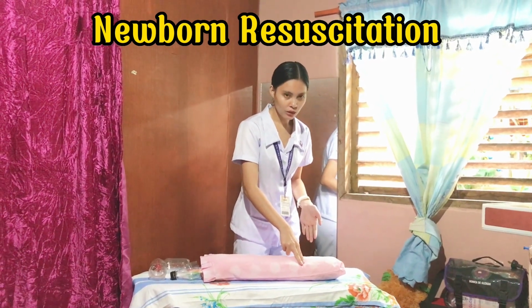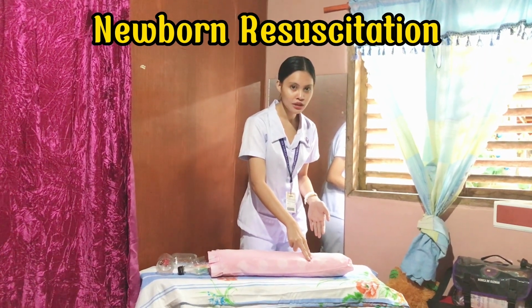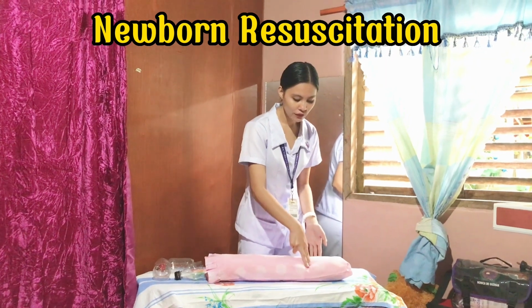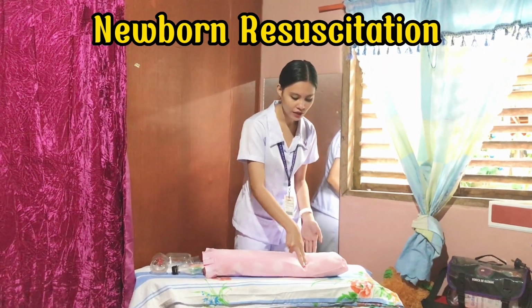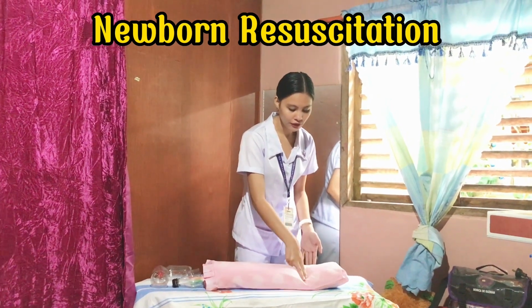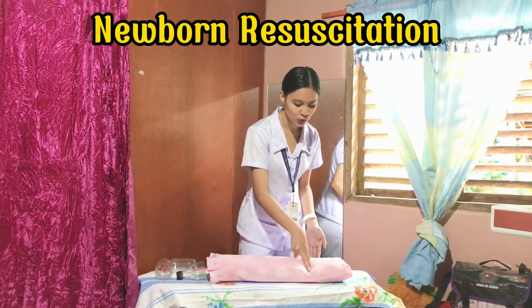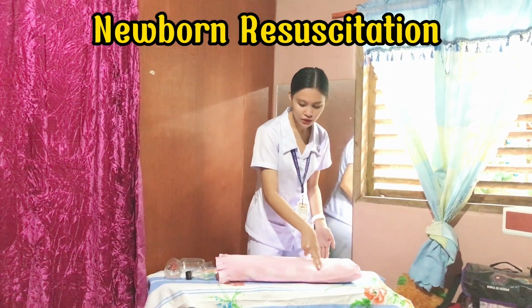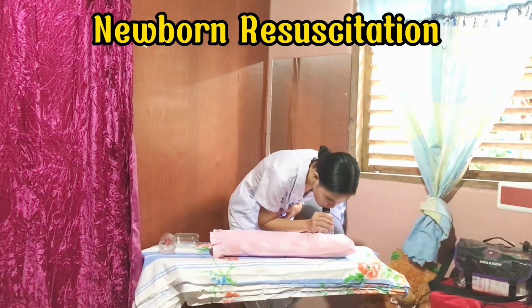We're going to do the chest compression at a depth of 1.5 inches. 1, 2, 3, 4, 5, 6, 7, 8, 9, 10, 11, 12, 13, 14, 15, 16, 17, 18, 19, 20, 21, 22, 23, 24, 25, 26, 27, 28, 29, 30. And then we're going to do the breath.